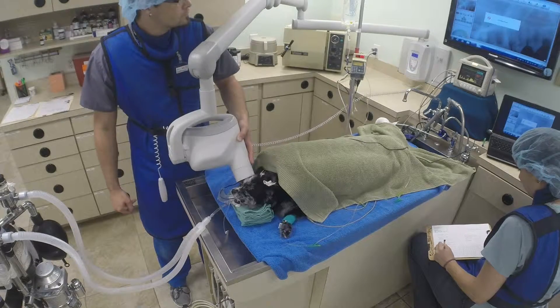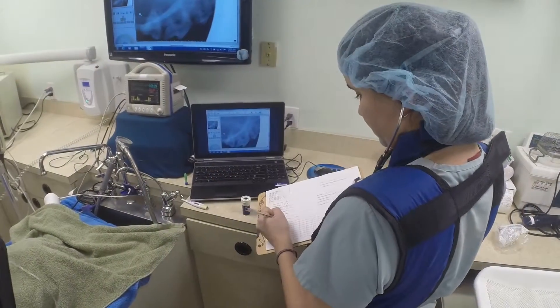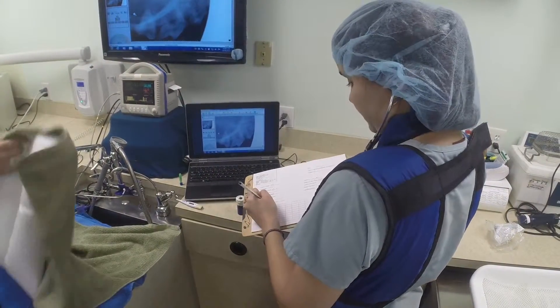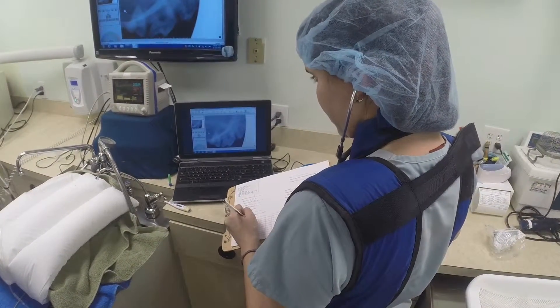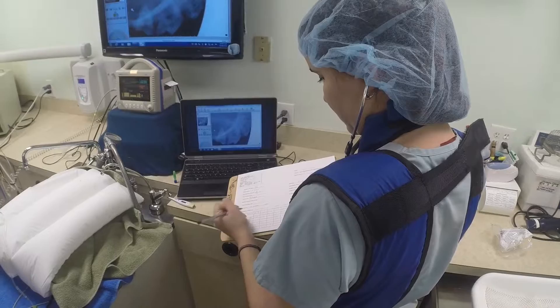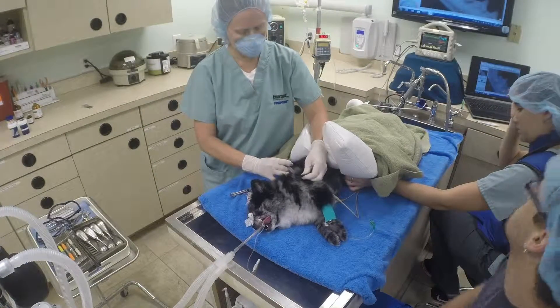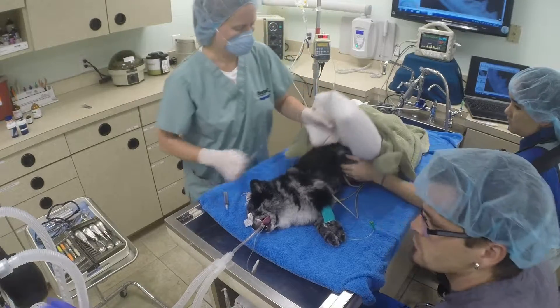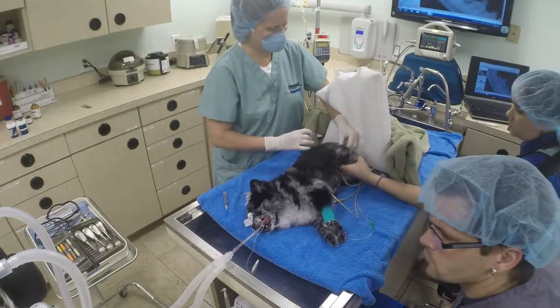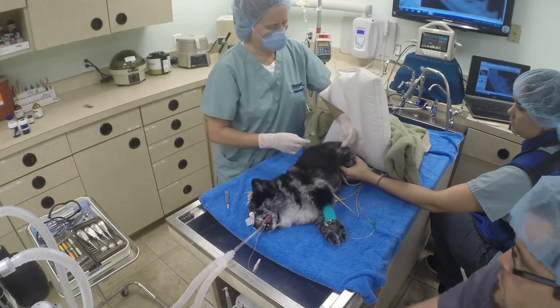Here at Town & Country, we have a trained technician that monitors anesthesia the entire time. Periodic findings are recorded in the animal's record during anesthesia. Our veterinarian gives an antibiotic injection and an anti-inflammatory injection. The antibiotic injection is used to treat any bacteria that may leak into the bloodstream during the dental procedure.